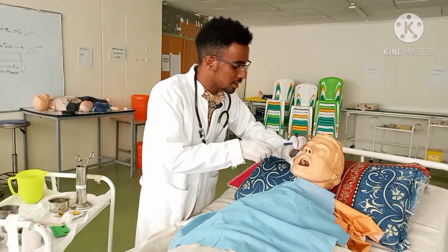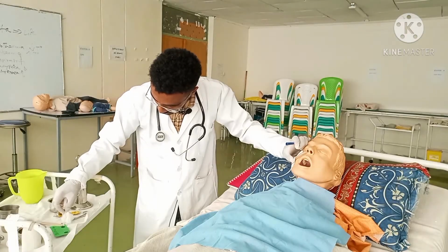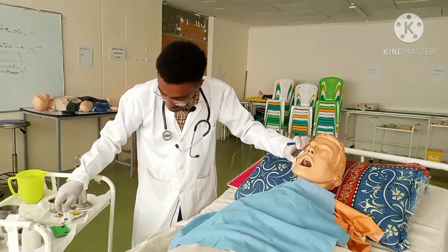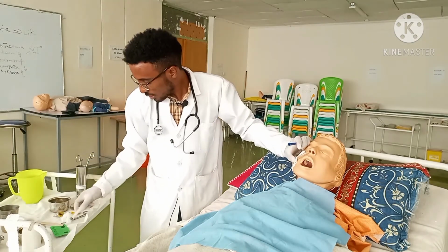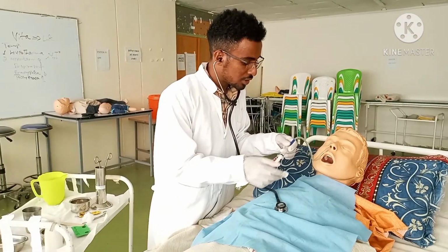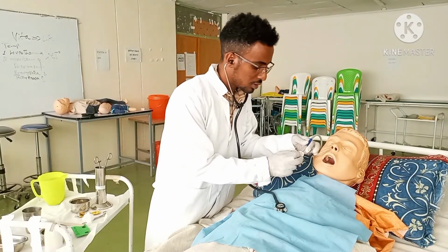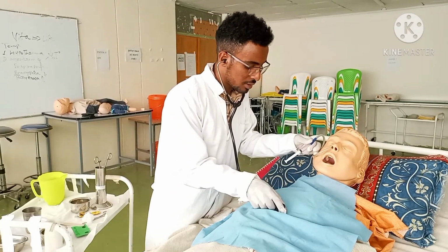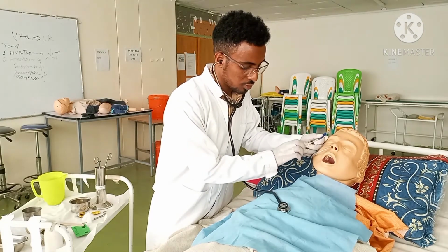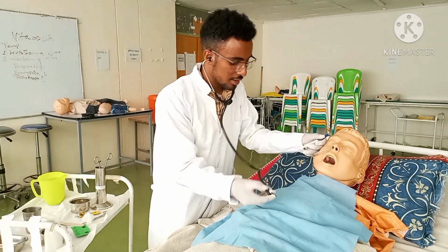Okay, here is a greenish gastric juice, and you can also use litmus paper. You have to apply it here on the blue litmus paper. If it turns red, it is in the proper place, that is the gastric acid. And also you can use a stethoscope. You can make sure whether the tube is in the gastric region by using air. While you are auscultating here, you have to push air, and if you hear air, it is in the stomach.